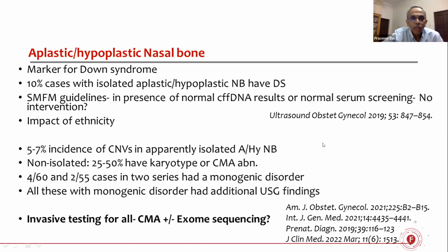Okay, Shagun, if you permit me, I know it's concerned with genetics, but there are a lot of people with a lot of confusion and a lot of questions regarding the nasal bone. First and foremost, I think in the first trimester we need to be very specific that there is nothing like a hypoplastic nasal bone. It's either absent or present.